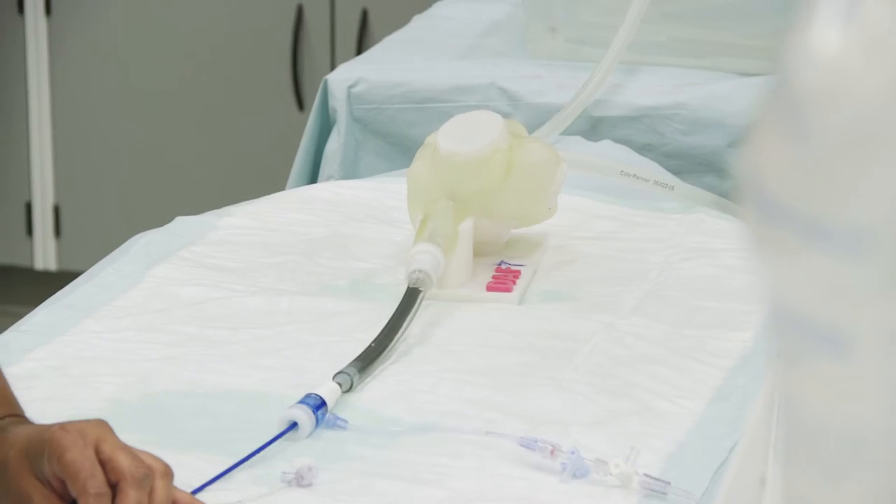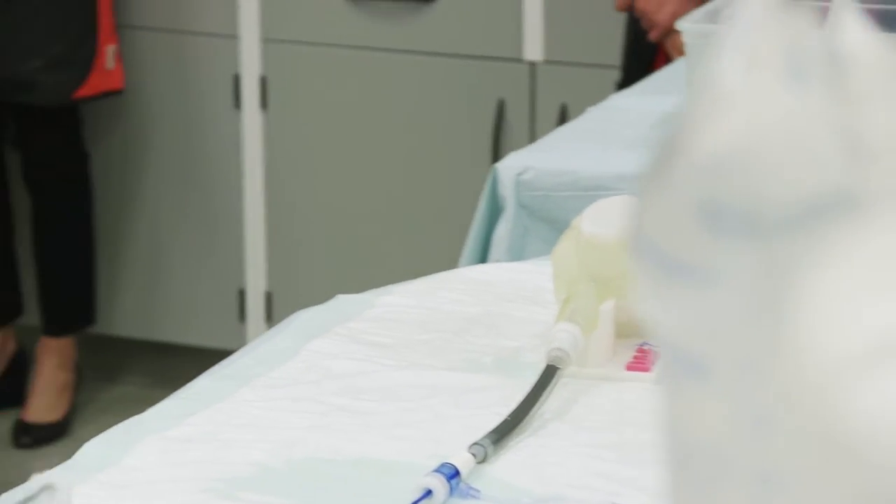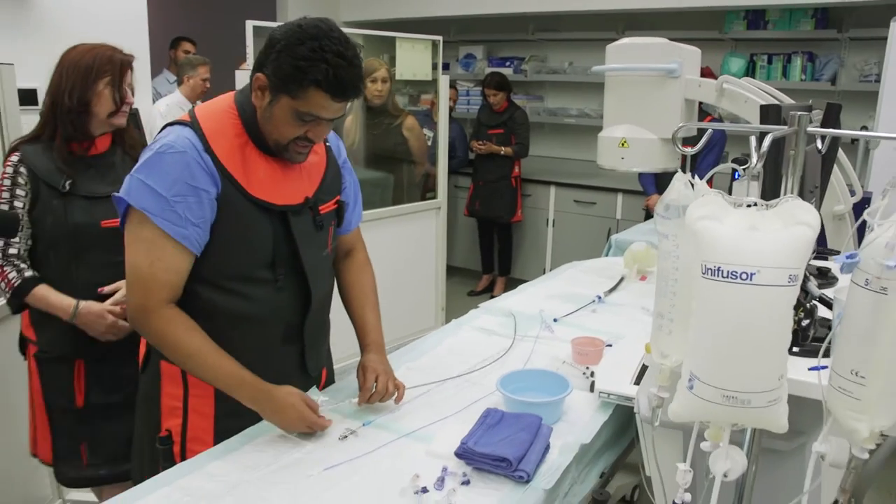Once we've done the transseptal, the next step is to get our devices in. I don't know if you'll be able to get this device in — it's a fairly large device meant for this, and it's really not sized for it.